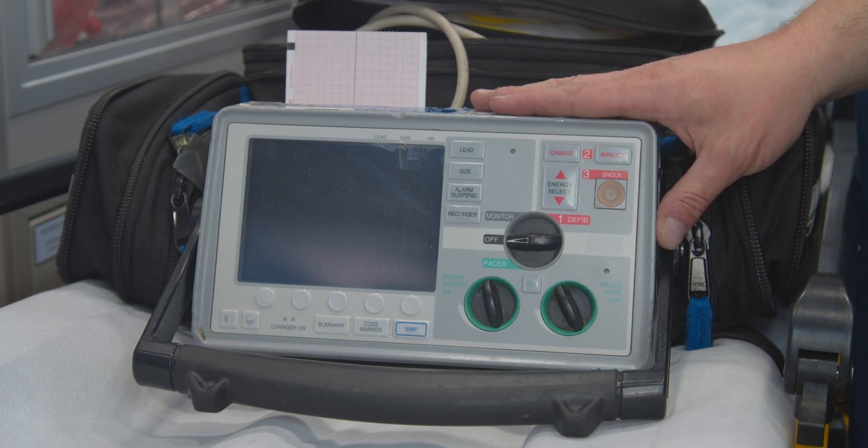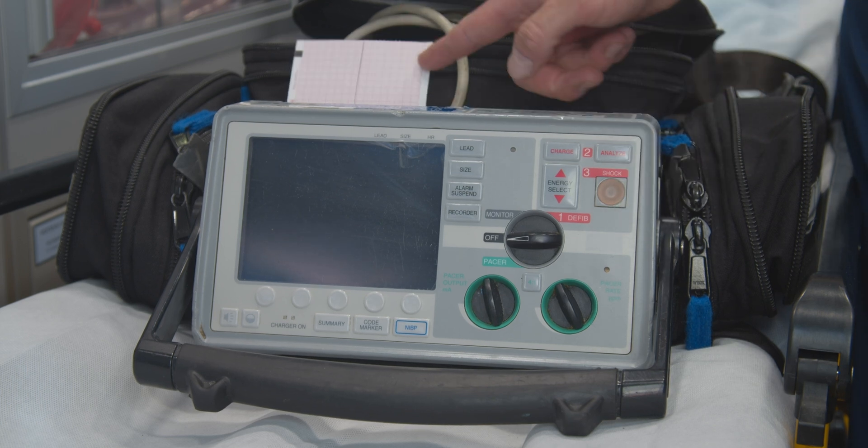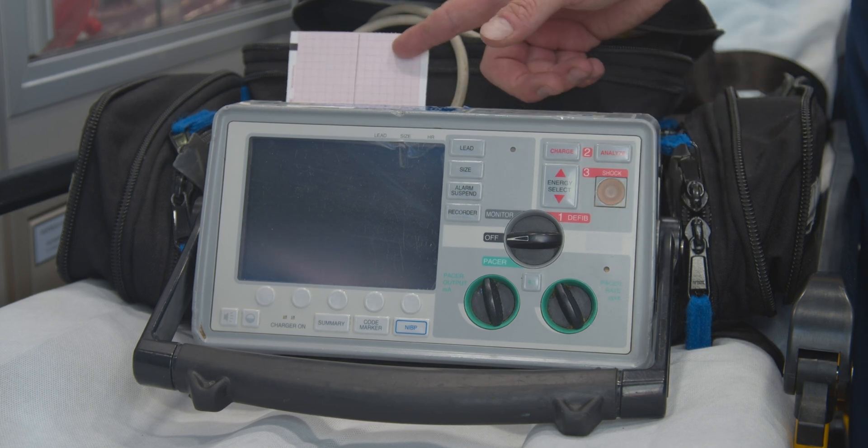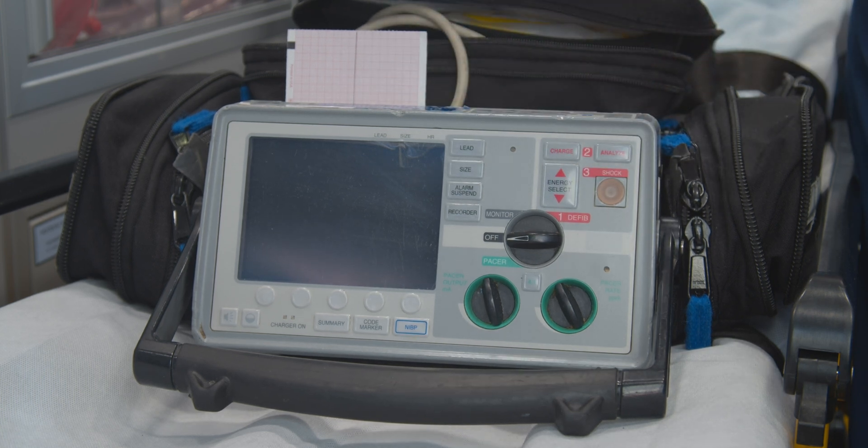That's all the functions for the Zoll E-Series that you really need to know. Just make sure you get a rhythm strip when you're picking up your patient before you leave — that's your baseline. You're going to get one somewhere mid-transport, and then you're going to get one when you drop off your patient.